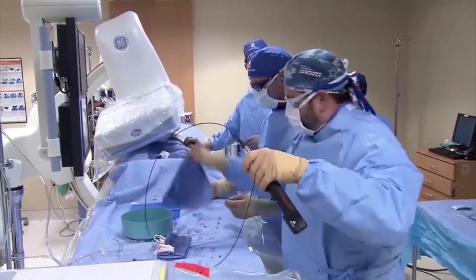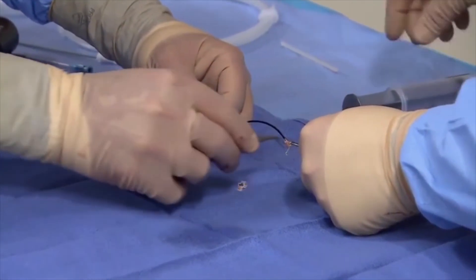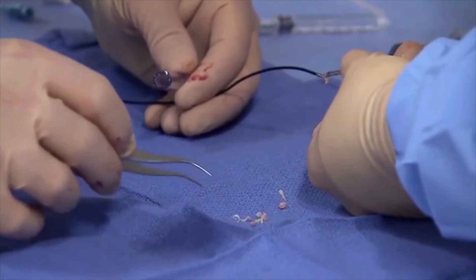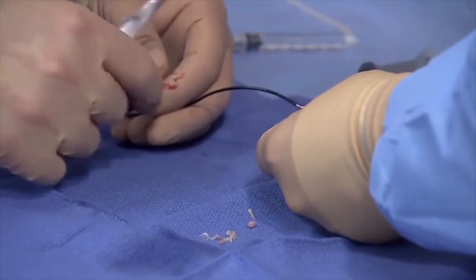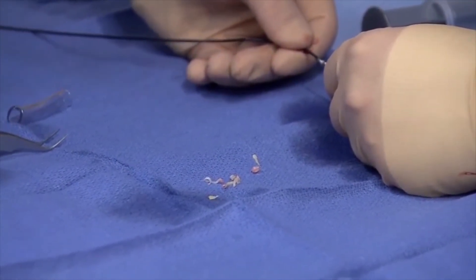James is cleaning the atheroma out of the tip of the device — you're seeing him push the plaque out. This is the bacon you had for breakfast, the cigarettes you smoke — all that bad stuff builds up inside your vessel. You can see it's white, glistening, and fibrotic; it's not a soft mushy plaque. This is the stuff that narrows the vessel over time, and if she does not stop smoking or change her lifestyle, this will return. What you're seeing is the atheroma being shaved out of the vessel. We've got one little area of mild narrowing about two-thirds of the way up the screen and we're going to make a couple more passes through there.